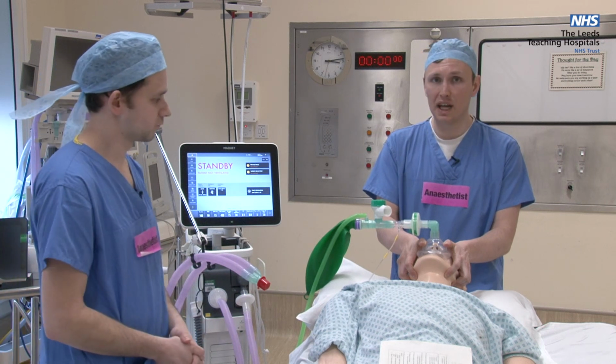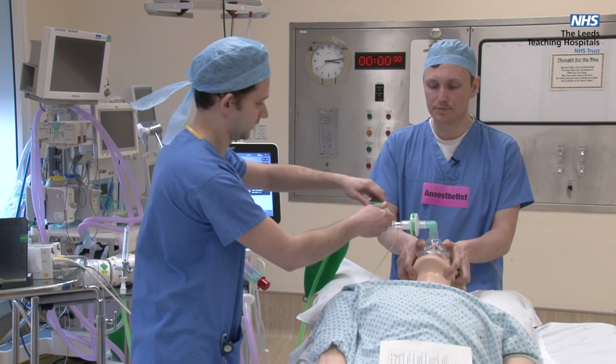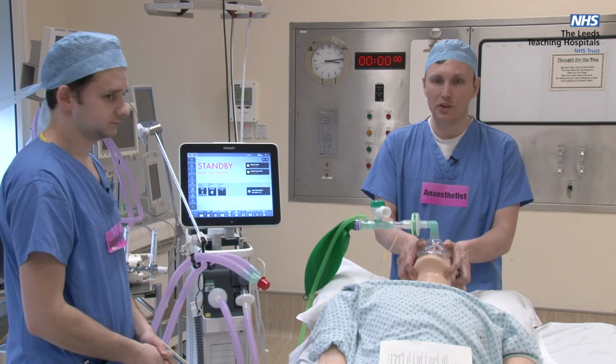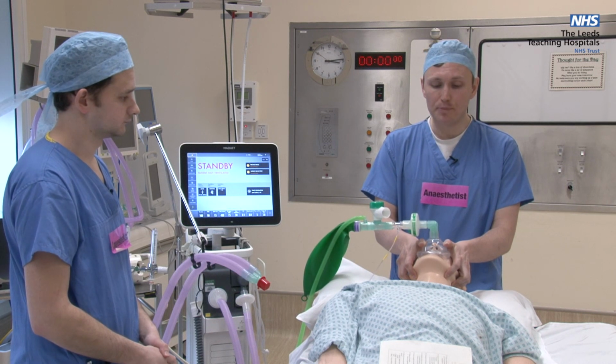And then screw down the APL valve to apply some CPAP to optimally pre-oxygenate the patient. So can you do that now? And valve is closed. Okay, thank you. So at that point, once the patient is pre-oxygenated appropriately, we'll then get Paul to give the drugs and I'll give him the instructions to do that.